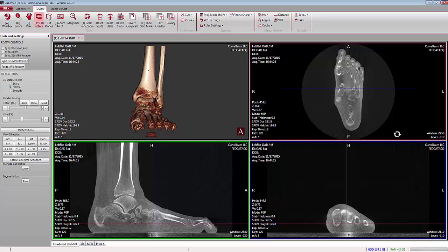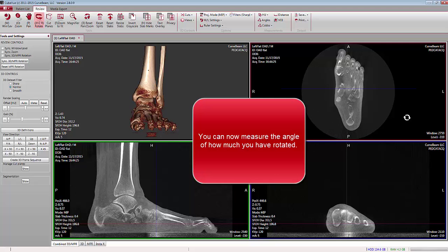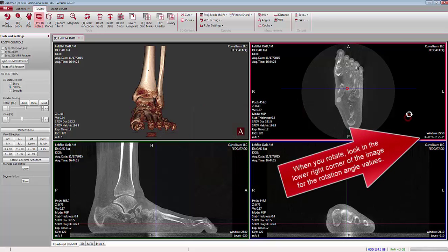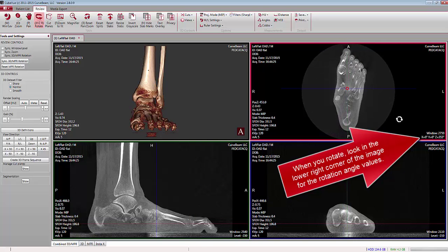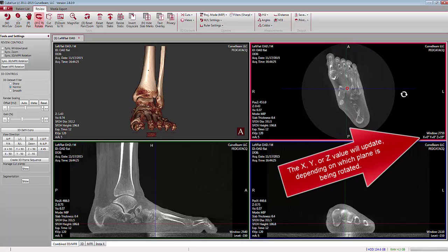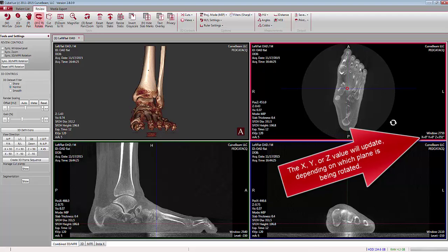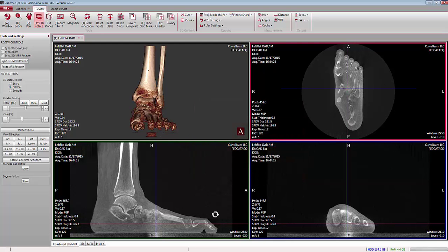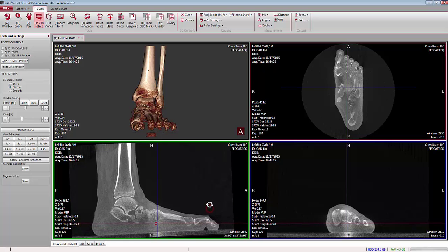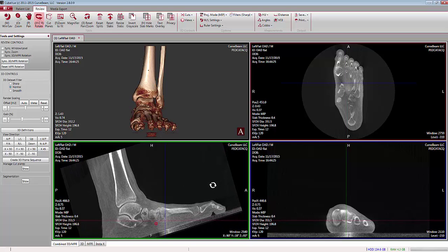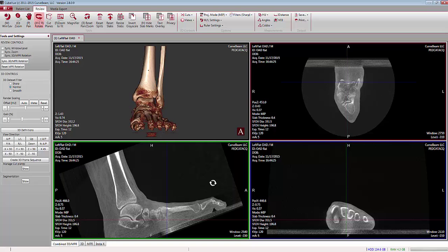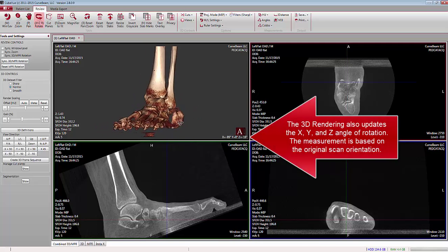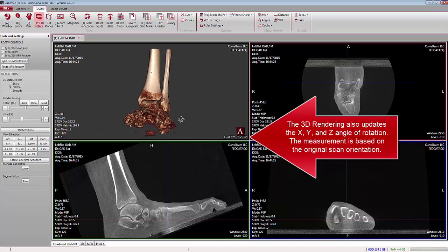Finally, one feature we're going to discuss is the ability to measure the amount by which we have rotated our data sets with respect to the original plane of orientation. If you press and hold the Shift key while rotating the axial view, look in the lower right-hand corner — you'll see X equals 0, Y equals 0, but the Z value is constantly changing. That is the angle of rotation being acquired with respect to the original orientation from which the patient was scanned. For example, to tilt the toes up approximately 20 degrees, press Shift and lift the toes — the Y value changes to 20 degrees. You can also see the X, Y, and Z values rotate and adjust accordingly as the 3D volume is rotated.